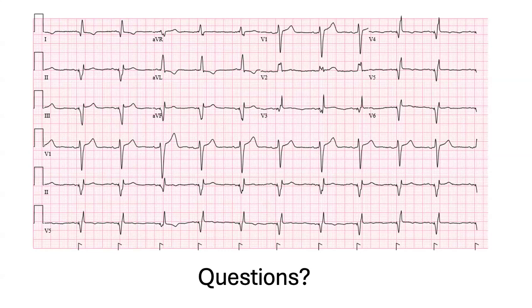Number one, the preponderance of evidence is still for CRT in patients that it's indicated for. So patients with heart failure, patients with a high degree of pacing, that's where we have all the evidence, and that's still a level one recommendation. However, it is a reasonable bailout, like Dr. Ngwu said, for those patients.